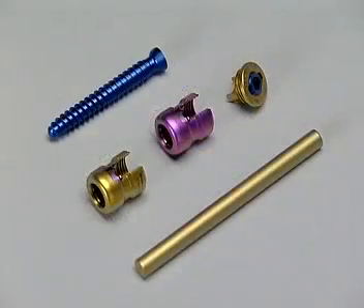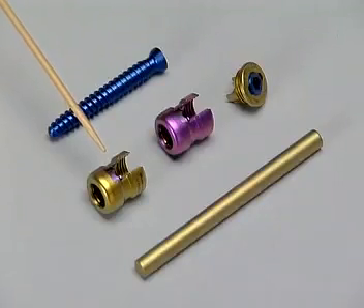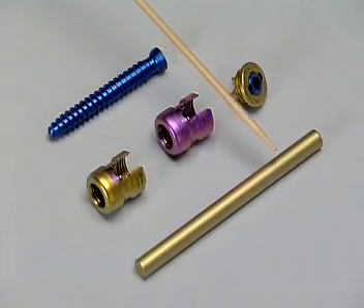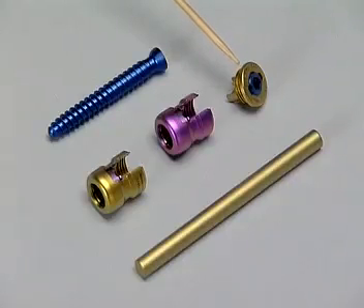The implants needed are Cliquex pedicle screws with a dual core and double thread, and Cliquex 3D heads. For demonstration purposes they are colored purple and can be removed; however, for use in patients they are gold colored and once applied cannot be removed. Also required are Cliquex 6 millimeter rods and Cliquex locking caps with an inner 3.5 millimeter hexagonal screw.